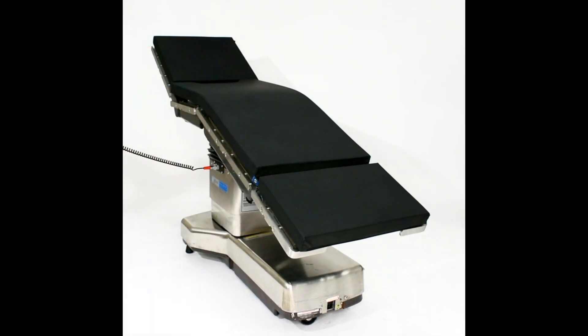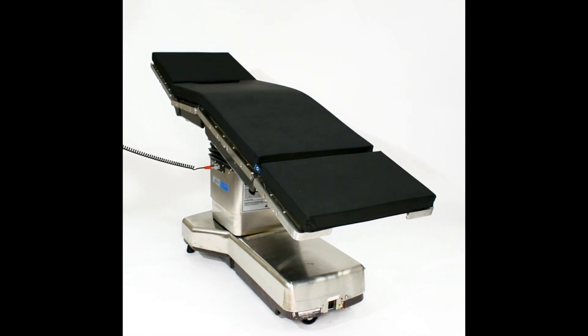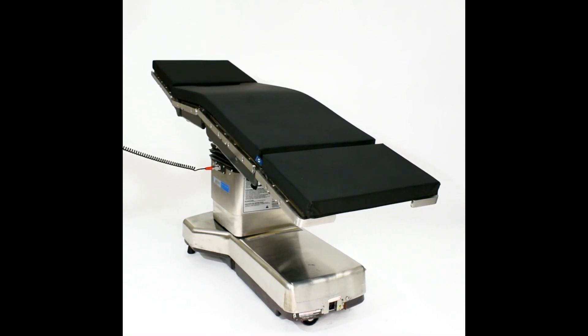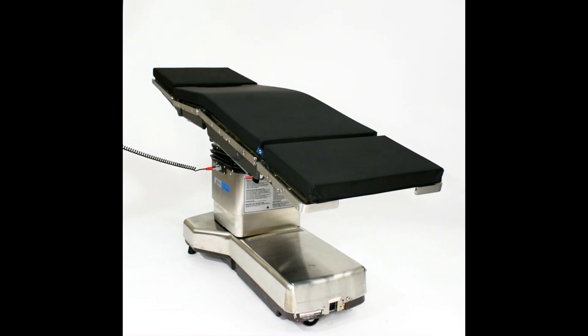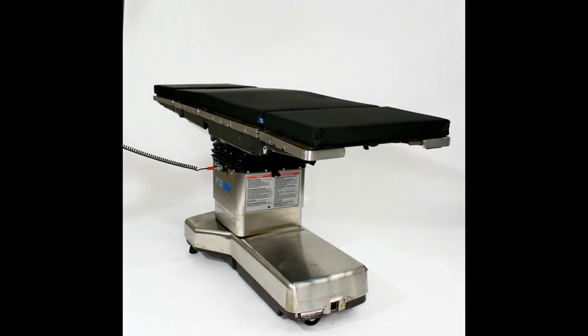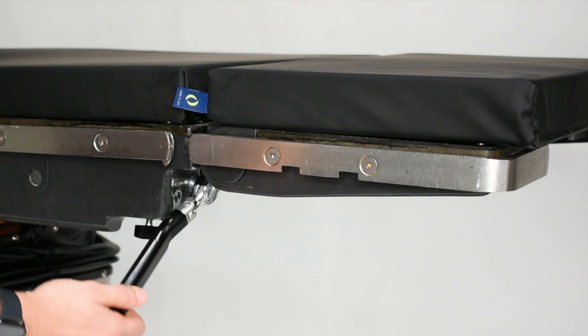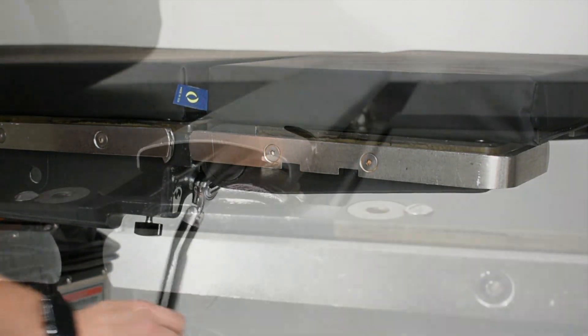The 3085 SP has a 1,000 pound patient capacity, power slide for C-arm access, a four-section tabletop, removable head and leg section, and reverse orientation for all patient postures. This table also features a manual kidney lift, seen here.